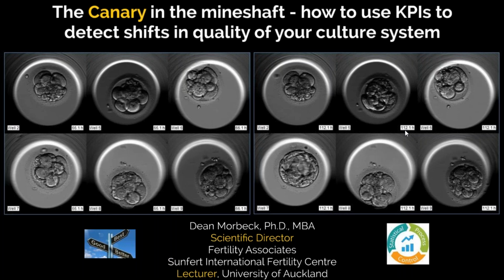Okay. The next question, don't you think efficiency of the embryologists plays an active role on this? Oh, yes. So everything that goes into our system is important. We can talk about, you know, I like to talk about oil, but the culture media, the incubators, the air quality, and the embryologists and how well they're doing.